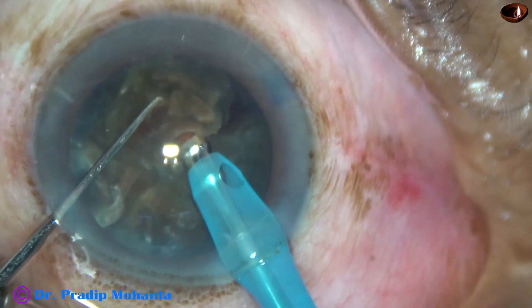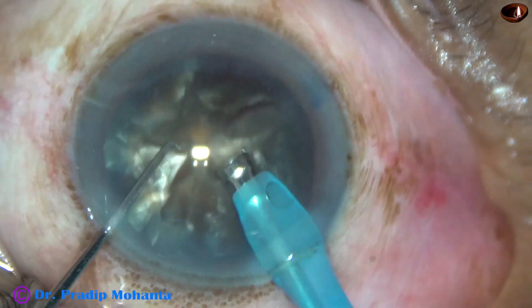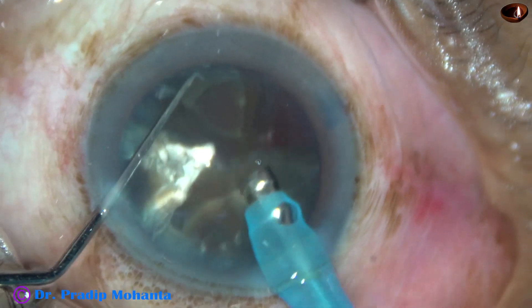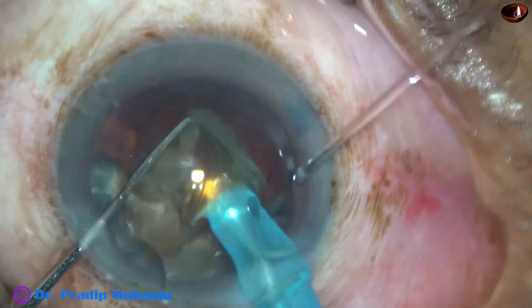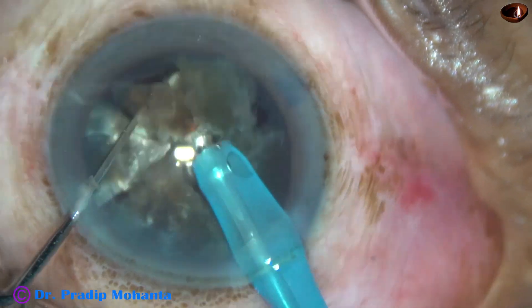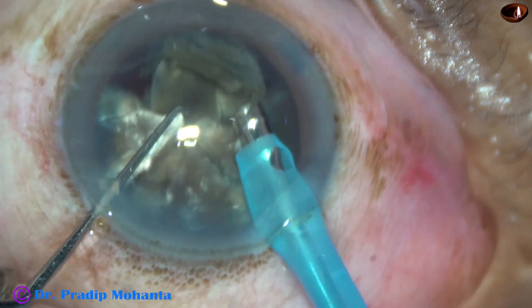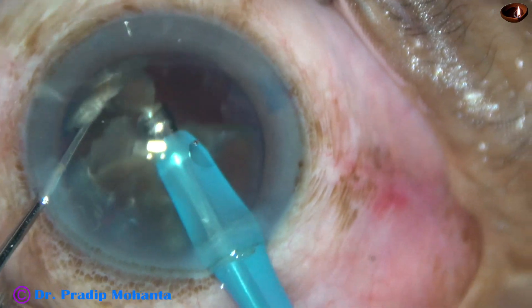Emulsification of the triangular pieces is carried out starting from the apex. The piece is tilted and emulsification is started from the apex. Emulsification of the pieces is carried out in the anterior part of the capsular bag just below the iris plane.